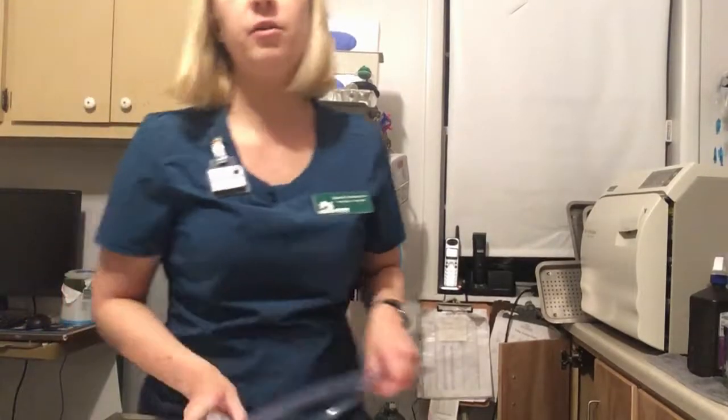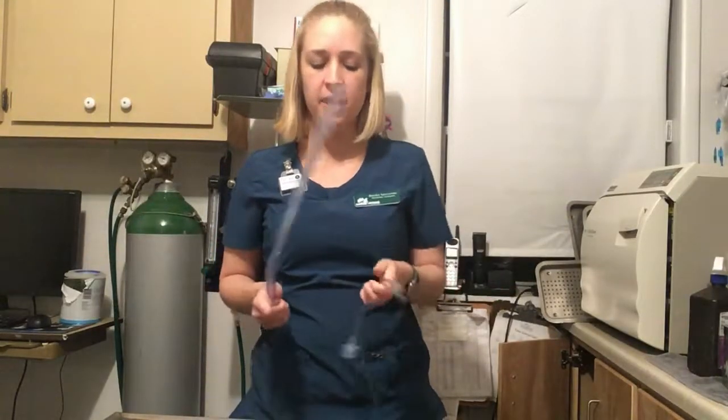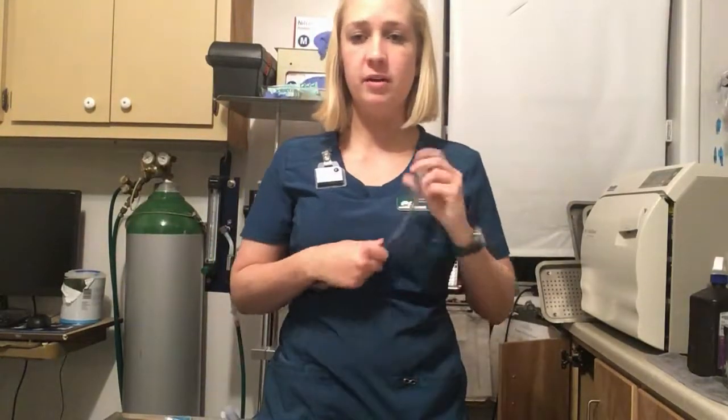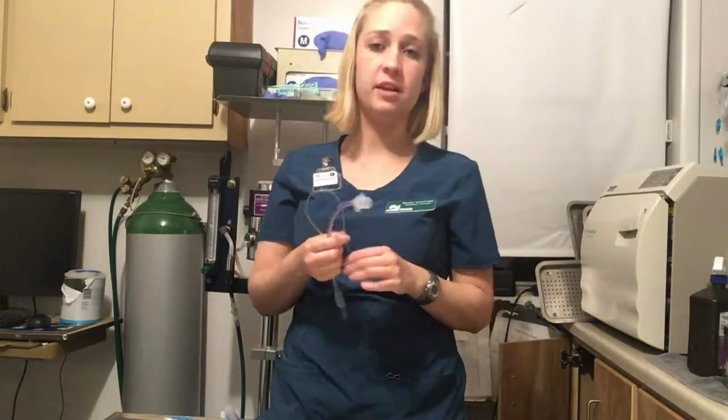So the next part I'm going to be going over is the endotracheal tube. There's a wide range of different sizes, and this corresponds to the size of the patient and the size of their trachea. The best way to measure for the length is by putting it up to their nose. It's not exact, but it does give you a good idea.